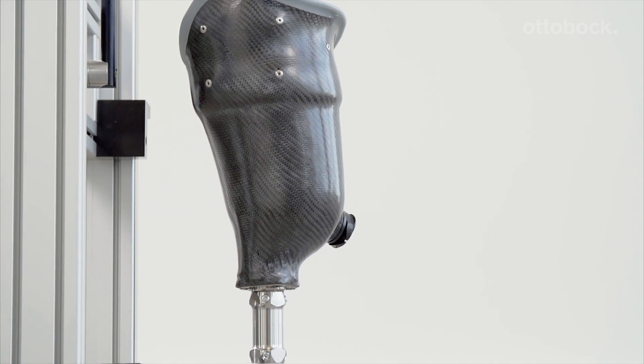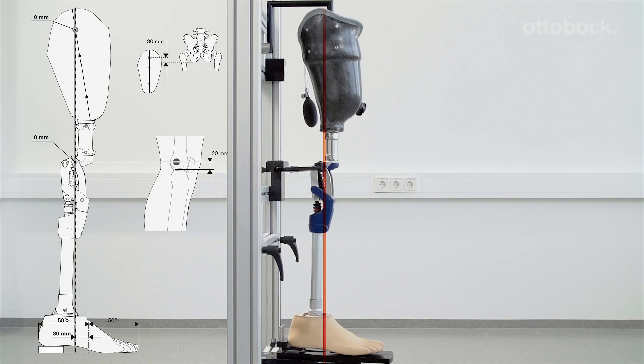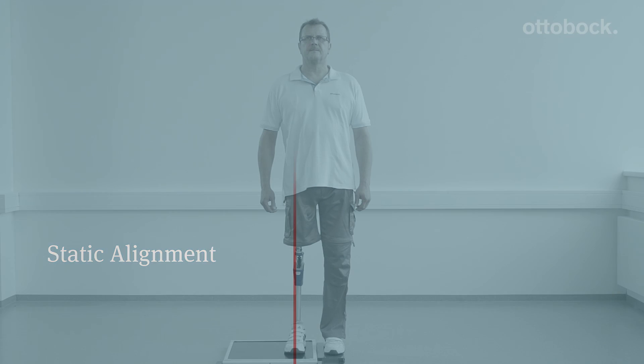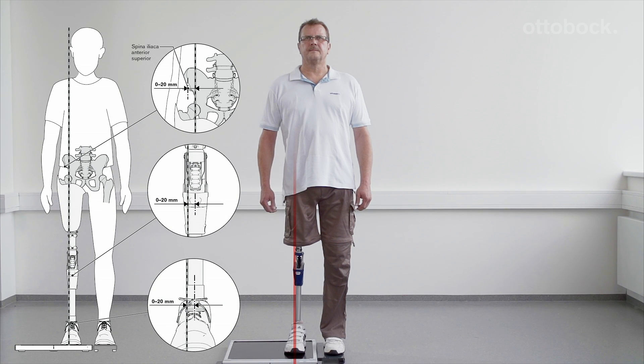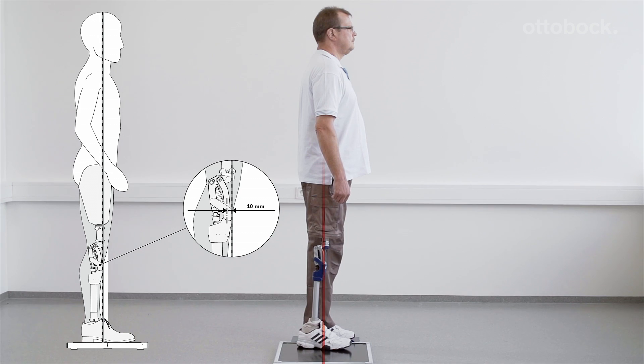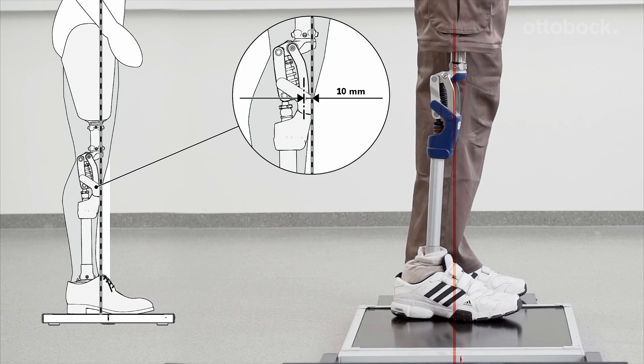For the correct bench alignment values, please refer to the displayed table. In the frontal plane, the alignment reference line runs through the middle of the prosthetic foot, the middle to outer edge of the knee, and the middle of the socket. The sagittal plane alignment should be adjusted solely by changing plantar flexion so that the load line runs about 10 millimeters anterior to the knee axis.